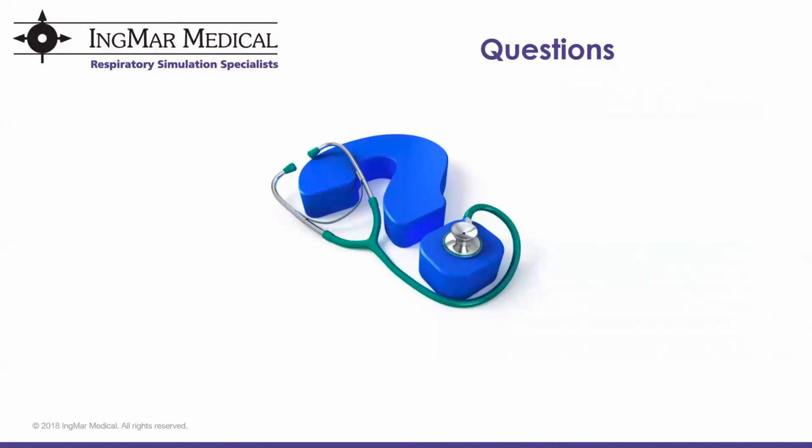So at the very least, it would be required for you to have those particular tools at your facility. In that case, these scenarios could be purchased to be added and enhancing your current system. And in fact, with initial purchases, we typically do offer a number of modules at no extra cost with the purchase of the system.